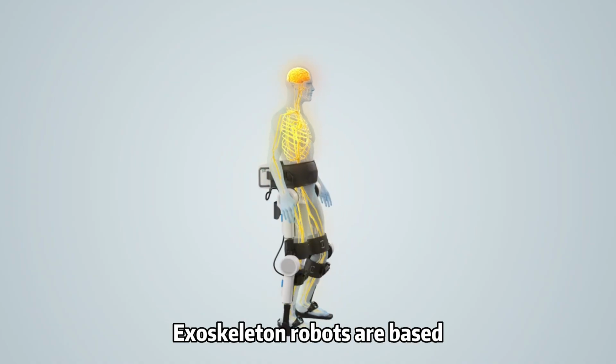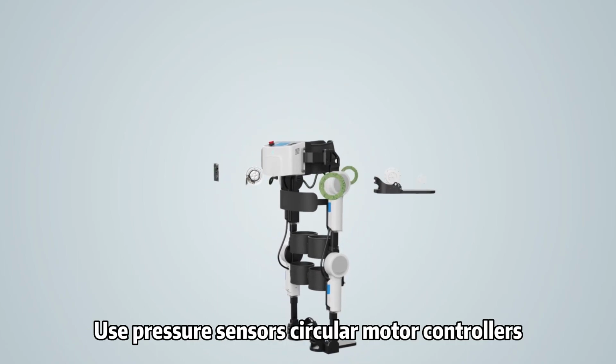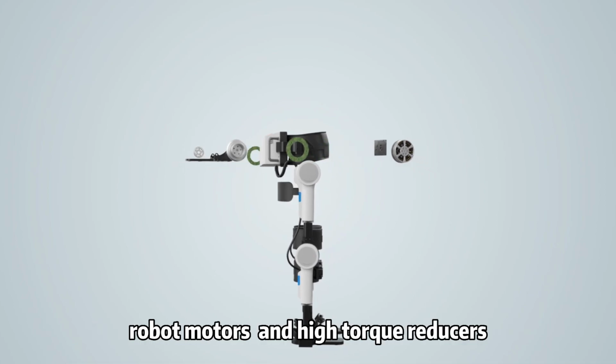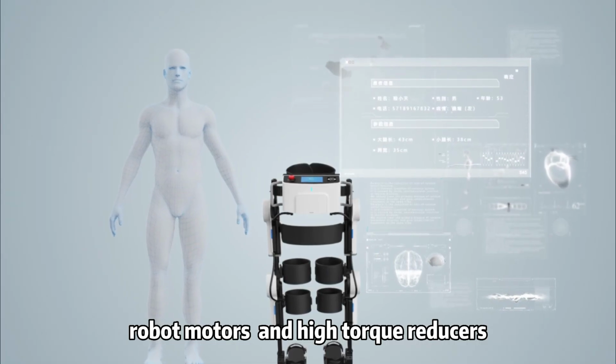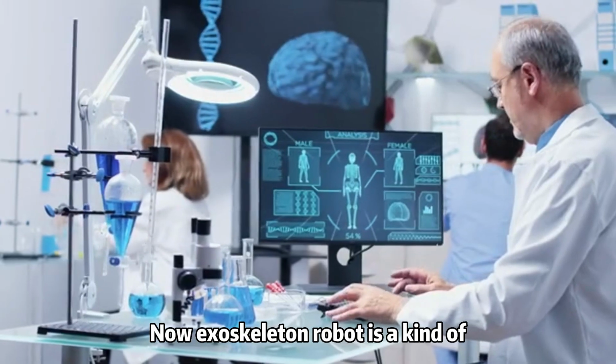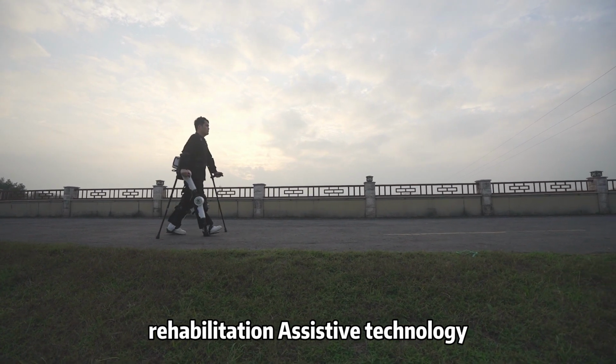Exoskeleton robots are based on the principle of neuroplasticity. They use pressure sensors, circular motor controllers, robot motors, and high torque reducers. Now, exoskeleton robot is a kind of rehabilitation assistive technology.